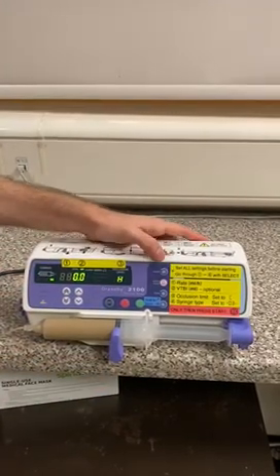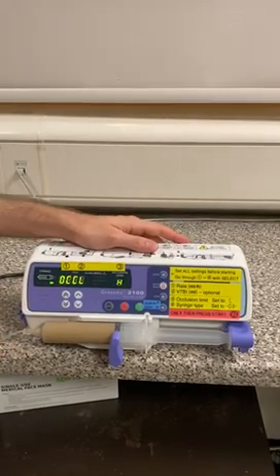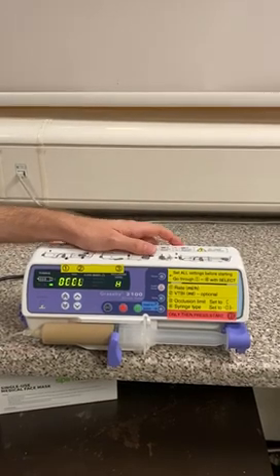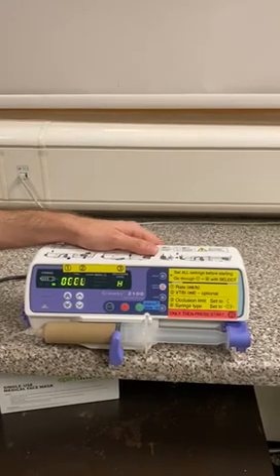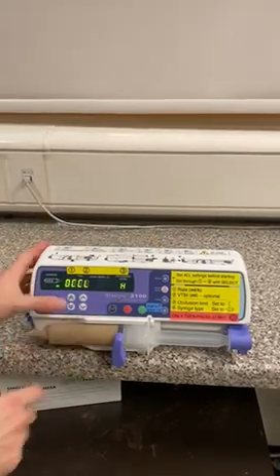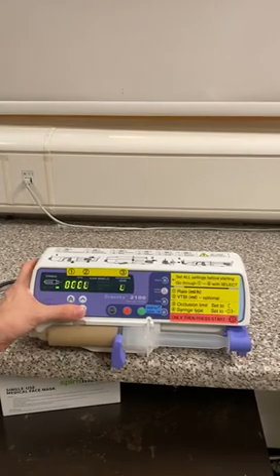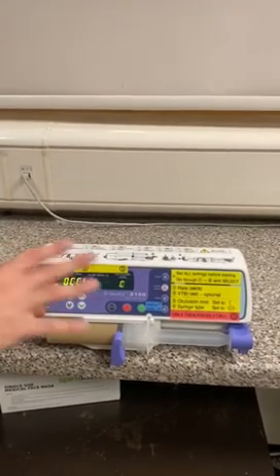The third thing: we press select again and it says OCHL — this means our occlusion limit. What we recommend is leaving the occlusion limit set to medium, because that's about equivalent to our normal Fresenius pumps. At the moment it's set to H for high, so we change that with the arrow keys. We can change it to H for high, L for low, or C for medium. So we're going to leave that on C.